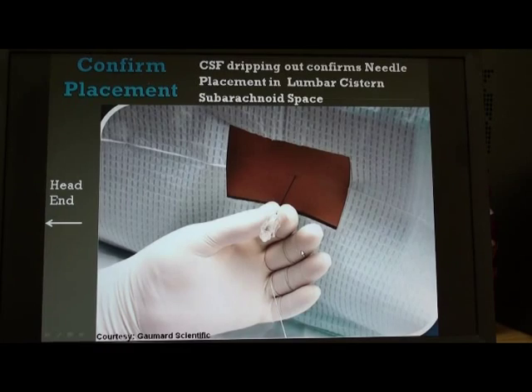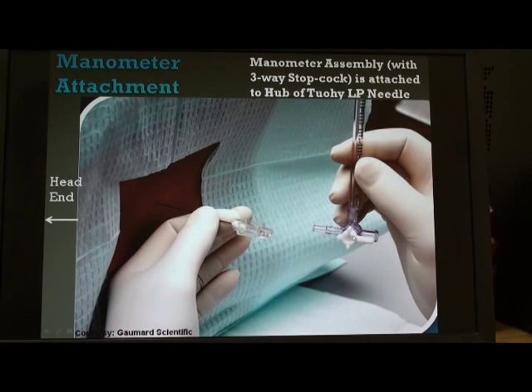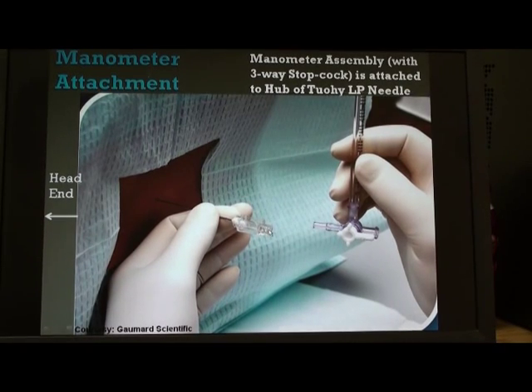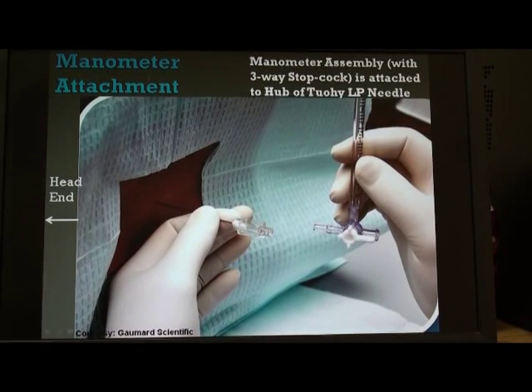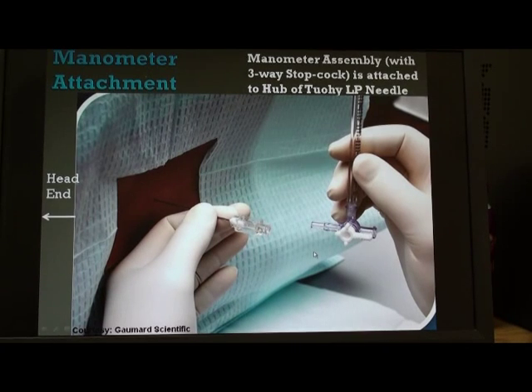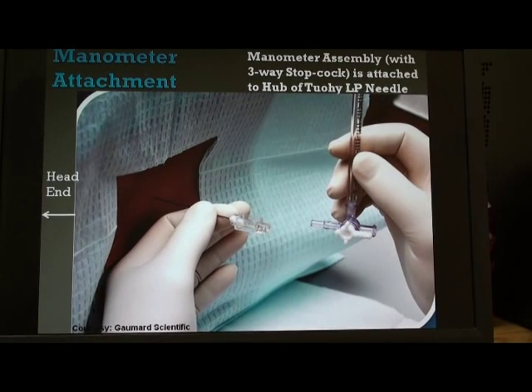Once we see the CSF dripping out, the next step is to connect the lumbar manometry assembly assembled earlier. The vertical limb of the burette records the pressure via the three-way stopcock, which is connected to the hub of the lumbar puncture needle and turned up so that CSF pressure is recorded. The normal CSF pressure in a normal person is 60 to 150 mm of water in the lateral recumbent position. There will be slight fluctuations based on respiration and spinal arterial pulsations.